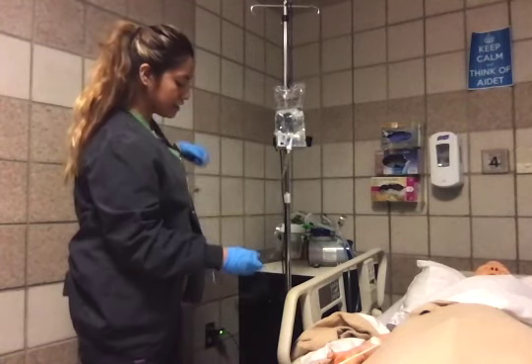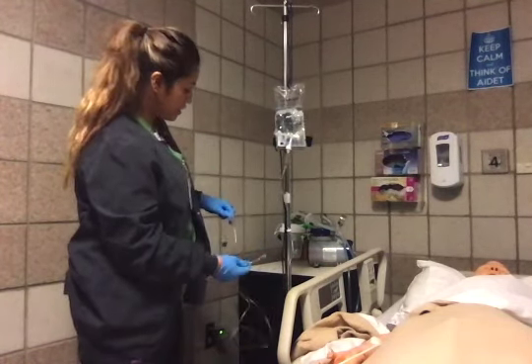And we're going to open it and let all the bubbles out. Alright, great. So it's flowing, the bubbles are out, and now we're going to clamp it again and hang it out of the way. And now we're going to get our secondary bag.